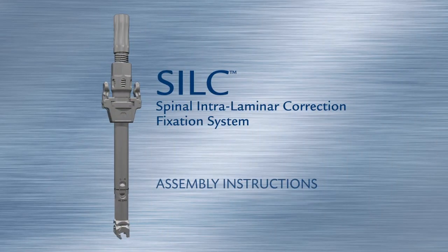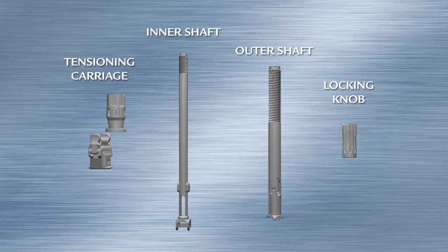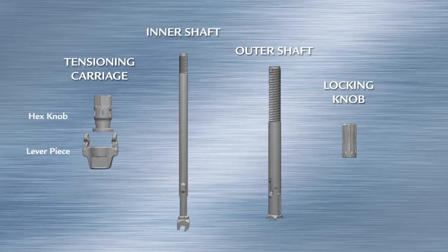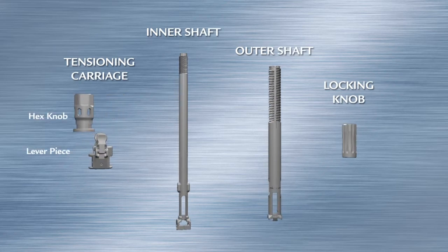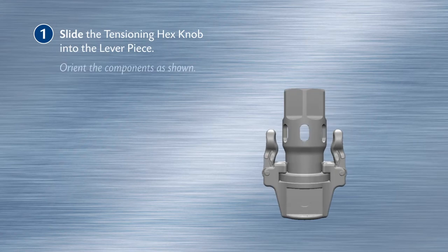Silk Spinal Intralaminar Correction Fixation System assembly instructions. The Silk tensioner is comprised of five key pieces: the tensioning carriage, the inner shaft, the outer shaft, the locking knob. Slide the tensioning hex knob into the lever piece.